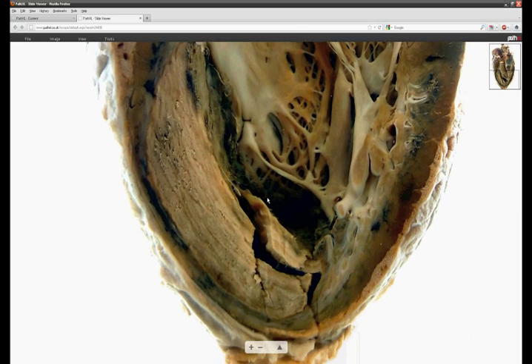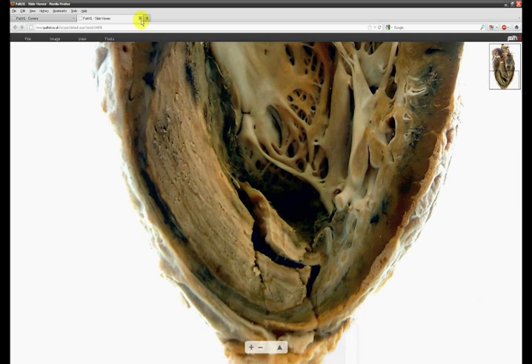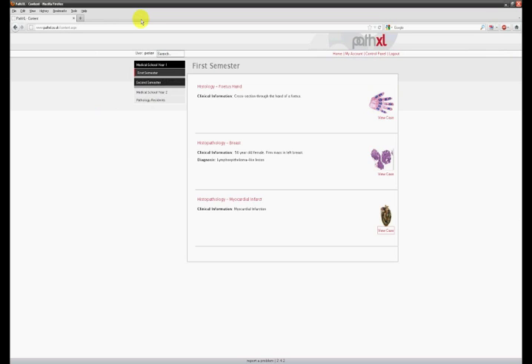to navigate and zoom. And as with digital slides, you can annotate and capture images from this sample as already described. PathXL Tutor has the ability to view all sorts of images, including standard photomicrographs, x-rays, blood smears, microbiology scans, cytology, gross dissections, and of course histology and histopathology through virtual slides.